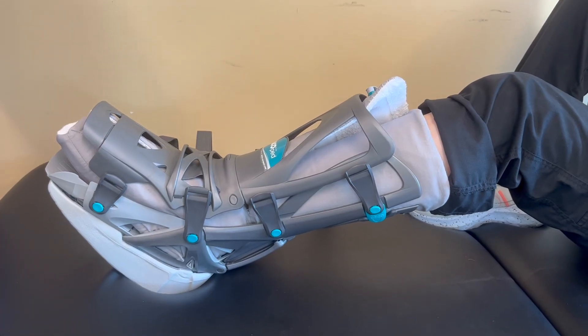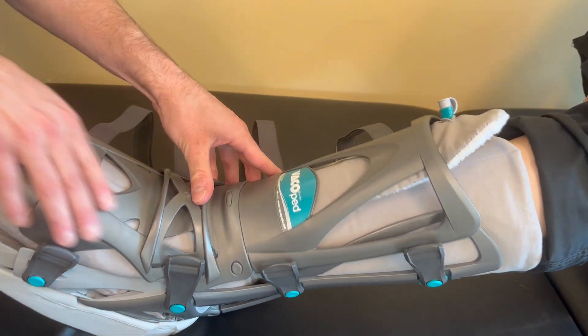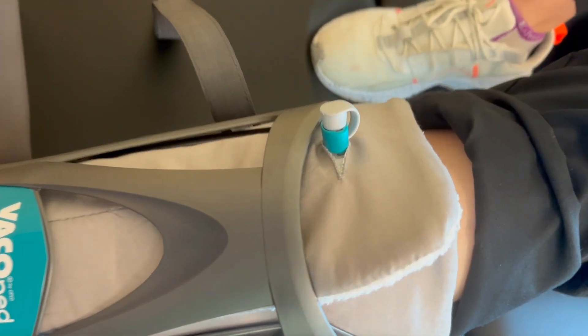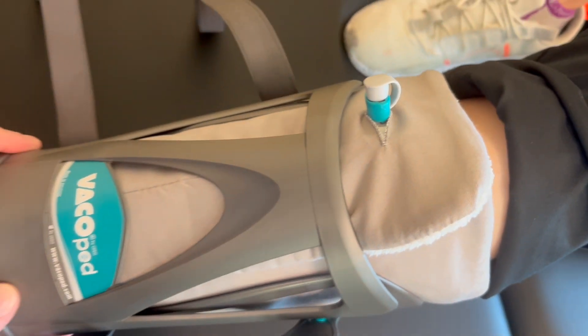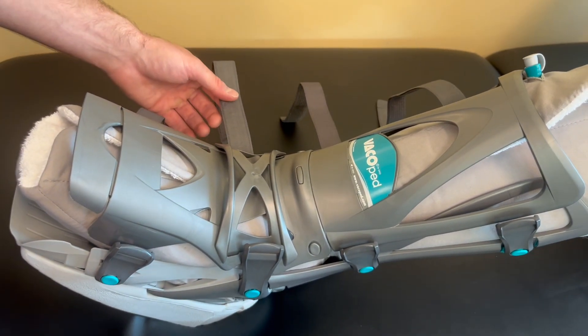Next, reapply the plastic outer shell by placing it over the liner in front of your lower leg. The bottom flap should align with the inside of the shell of the boot and the top flap should wrap around the shell of the boot. Please ensure that the valve for the vacuum feature of the liner is on the outside of the front panel and not through the hole.